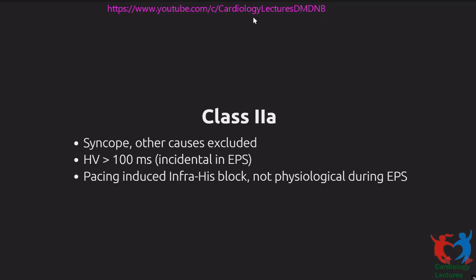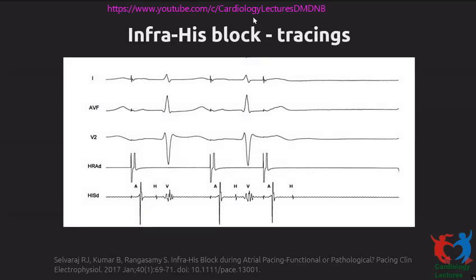tricky. Now, by itself, infrahisian block seen during an EP study is not uncommon, and it's very difficult, or at least let's say not easy, to distinguish a physiologic infrahisian block from a pathologic infrahisian block. So let me demonstrate with an example here.